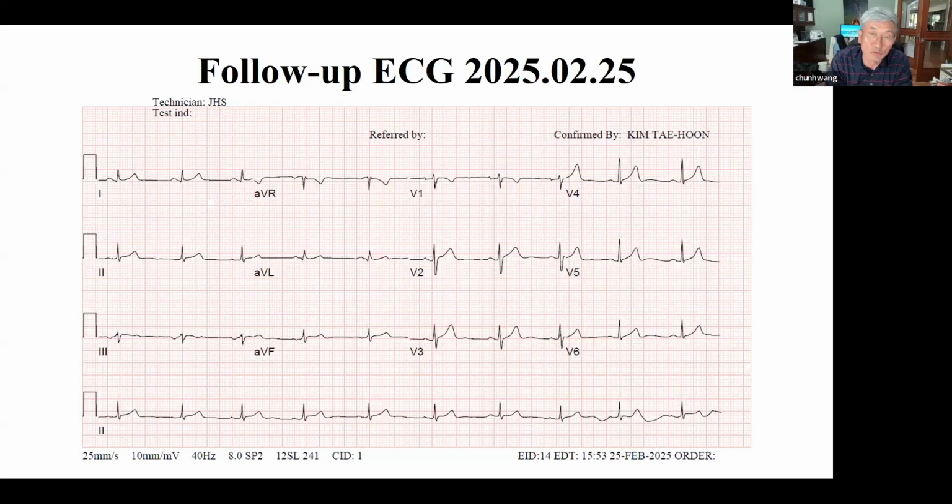Second, obviously, you're trying to make a diagnosis of the palpitation and tachycardia, and so on. So typically, persistent left superior vena cava is known for what? Atrial tachycardia like this. What else? Atrial fibrillation, focal arrhythmia, reentry. It's a very important cause of persistent atrial fibrillation in these people, because in many of these, the superior vena cava at the posterolateral junction of the left atrium is connected to musculature. So they involve the left superior pulmonary vein, inferior pulmonary vein, carina, anterior carina, and appendage muscle, all attached together. It's very difficult to isolate.